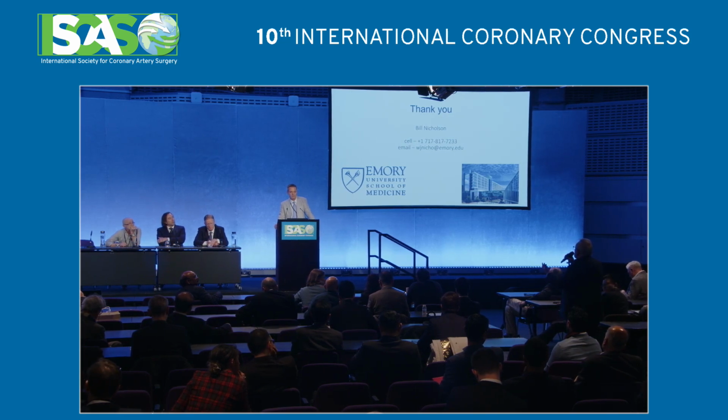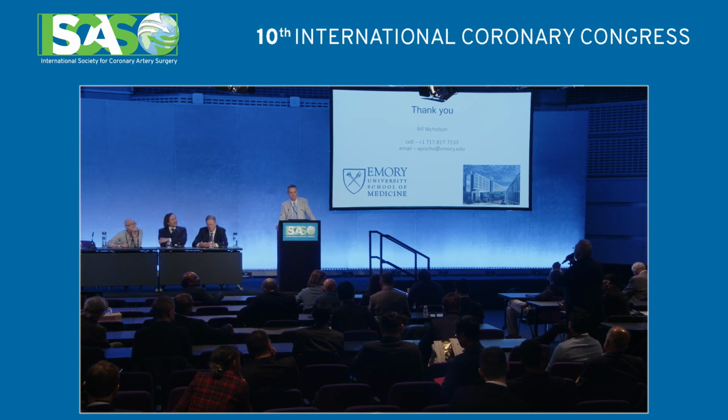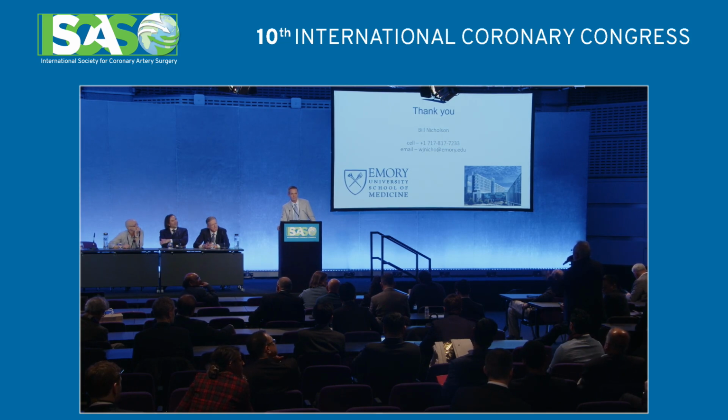But when the interventional cardiologists see the CCTA and the extent of calcium, I'm surprised by the fact that they back up from PCI. You have seen the pictures of the case of John: the calcium is very, very proximal, and the distality is most of the time nice. You don't see calcium in the PD massively, but the way to go there can be terrible.